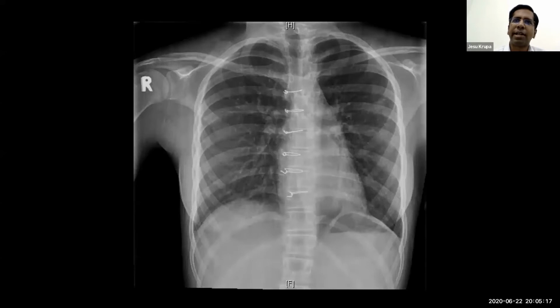So as you can already appreciate, the Chitra valve was easy to see. You already got a clue. Here you are not able to see very clearly, but you should try to look, lest you write off saying this could be a bioprosthetic valve or something like that.